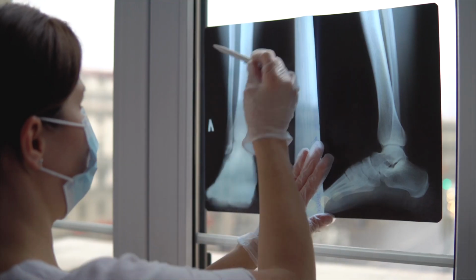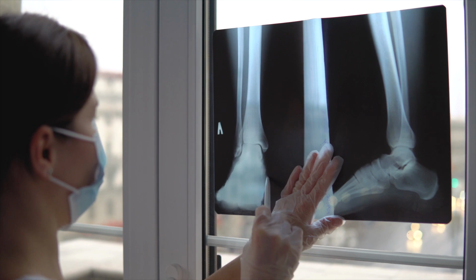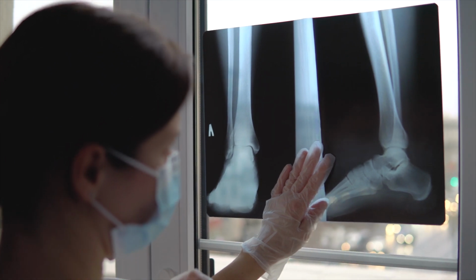MRIs show bones too, but MRIs are actually not the go-to when it comes to looking at bones. That's X-ray and CT scan. So in some cases, an X-ray is actually a better picture of what's going on. For instance, if you have a fracture, if you have a broken bone, an X-ray is actually gonna be better in a lot of cases than an MRI for that. So it's not that an MRI is the end all be all for imaging. It's just more detailed than some things the X-ray can't show. But it's not always necessarily the best thing. It's not always what you need right off the bat.